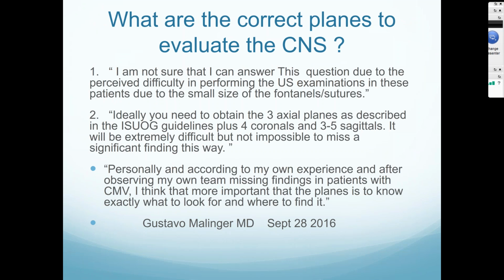So I asked Gustavo last year, before the presentation, if we're trying to teach how to get the best out of an ultrasound in the central nervous system, and you see the question is real simple. What are the correct planes to evaluate the CNS? And his answers are here. I'm not sure that I can answer this question due to perceived difficulty in performing the examination in these patients due to the small size of the fontanelles and sutures. So that's not a knee-jerk response. That's a real-life response in someone that's had experience in trying to make this diagnosis.